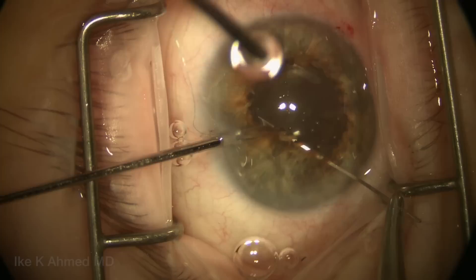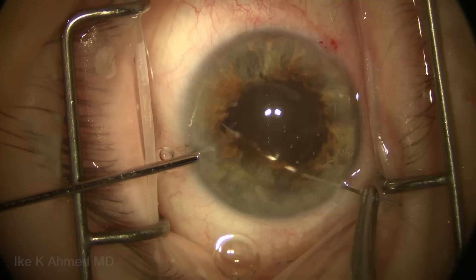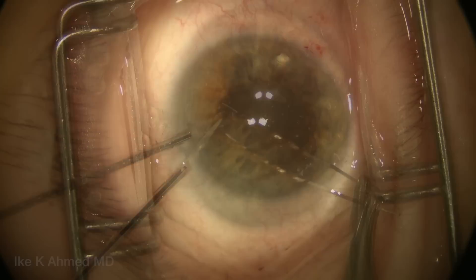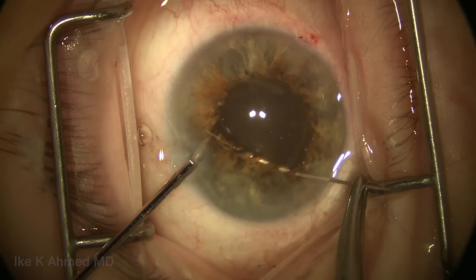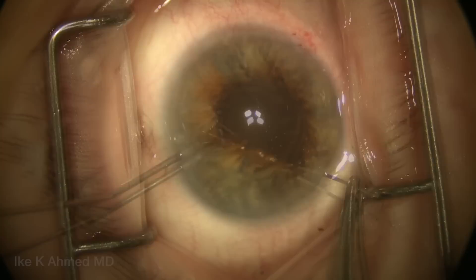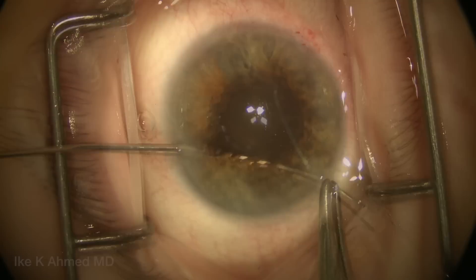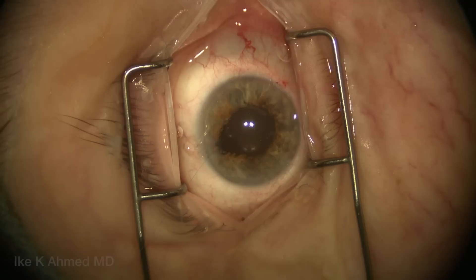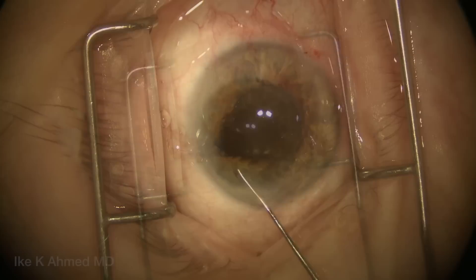It's important not to try to finish off too early — if we do, a small notch can form, which isn't the end of the world and can be addressed with an additional simple suture, but it's best to get it done with one suture. We're now ready to dock the needle with a 27-gauge cannula, inject viscoelastic if needed, and gently push and pull with the needle driver, releasing from the docking needle and pulling the needle completely out. Both ends of the suture are now out through the superior paracentesis, and we cut the needle off both ends.